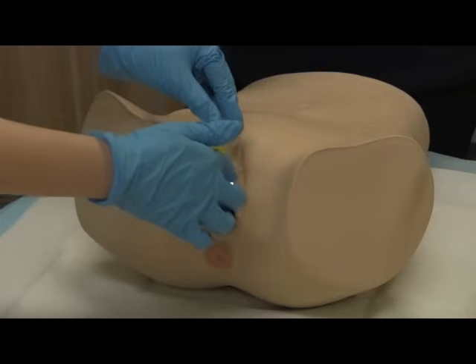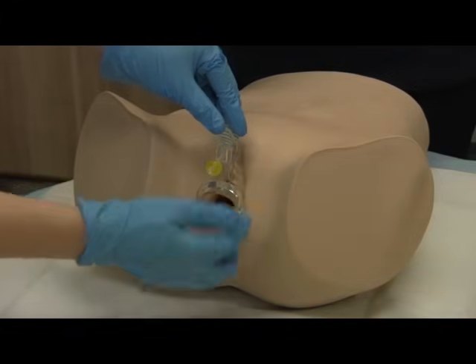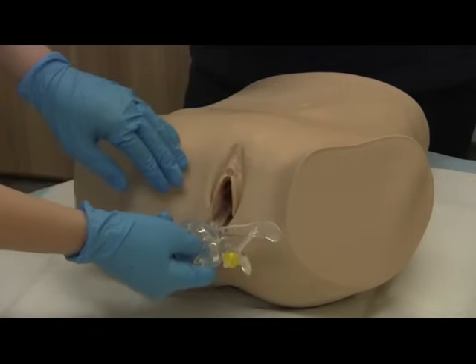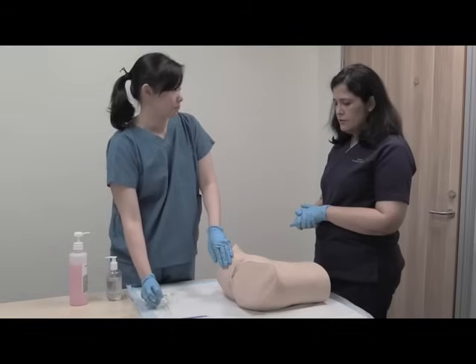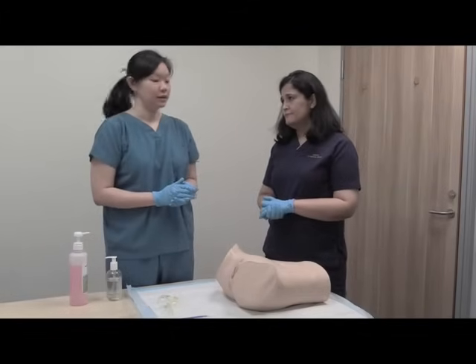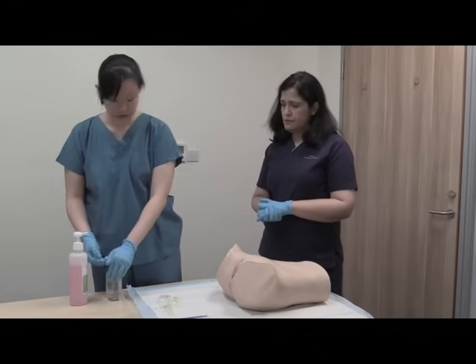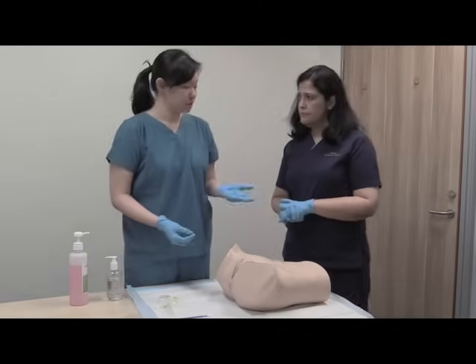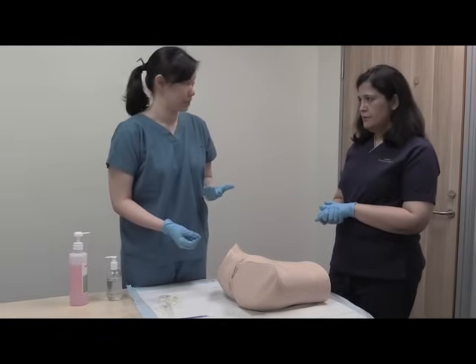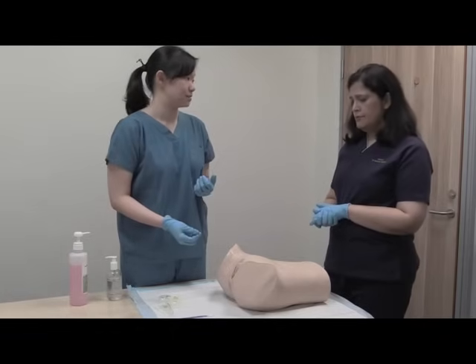When we are done with the pap smear and the speculum examination, I will release the self-retaining knob, let the speculum close, and ease it out gently so as not to cause discomfort. That was not bad at all, Doctor. Now we will move on to the bimanual examination. Again, I need to have lubrication. Mrs. Smith, I will now perform the bimanual examination for you — it's an internal check. It might cause a little discomfort, but if you relax yourself it will be done in just a moment.